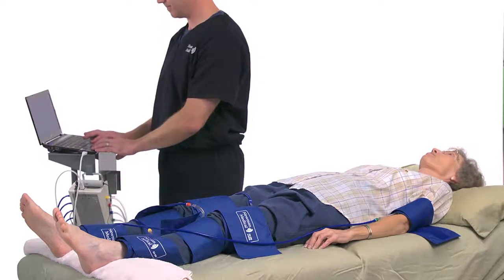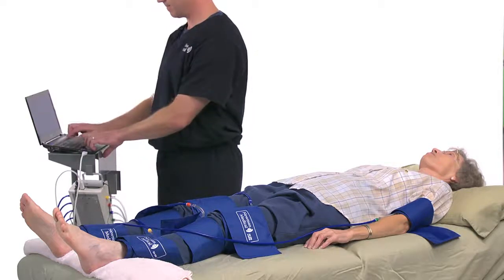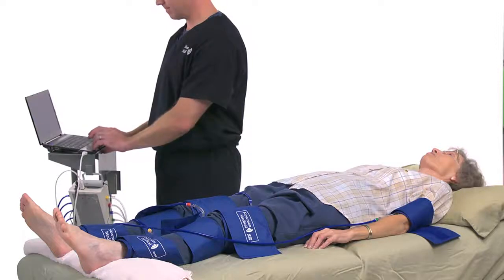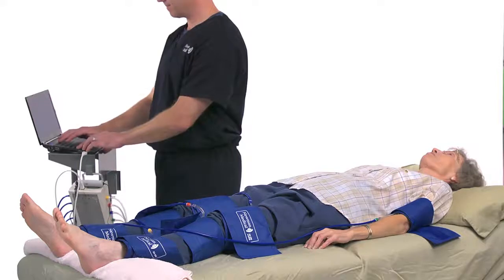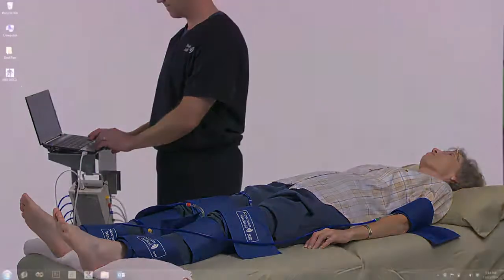Wrap appropriate-sized cuffs, usually 12 cm on the arms and 10 cm on the ankles, as explained in the section on cuff wrapping. Generally place the calf cuff just below the bones of the knee. For this segmental test, you may use a 12 cm long cuff high on the thigh or a wide 17 cm contoured cuff. Connect the cuff link to the cuffs using the color-coded hoses.